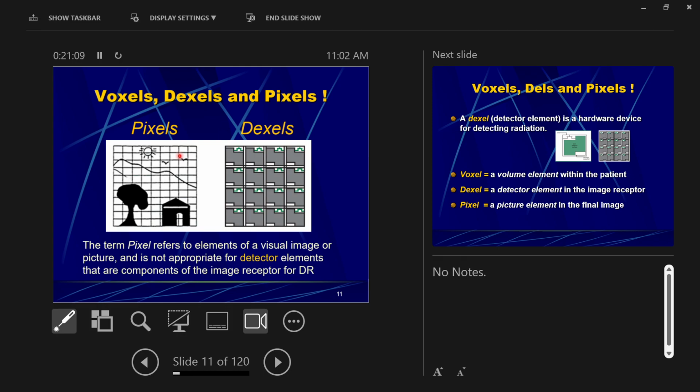And each square can produce a range of colors, right? We learned that the range of colors that can be produced is dependent on the software's bit depth. If you guys remember that phrase, bit depth, dynamic range, grayscale, right? So the number of colors or shades of gray that each pixel can show is dependent on some software stuff.